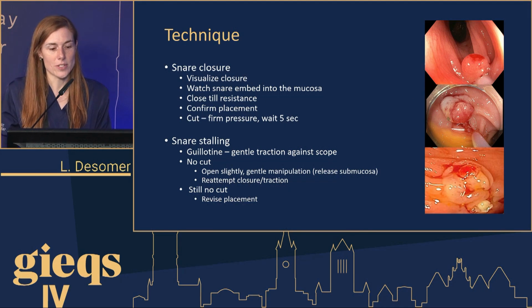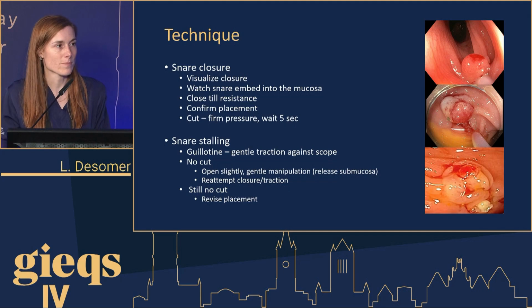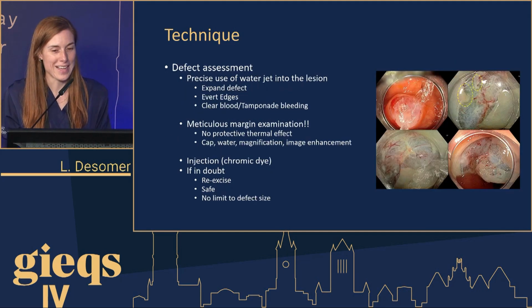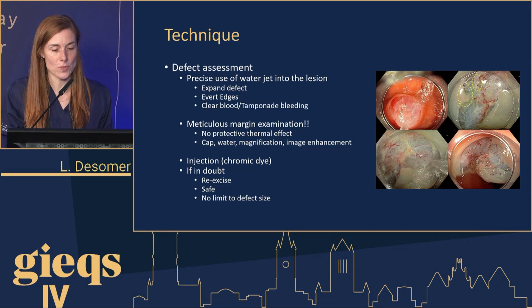Visualize snare closure, close till resistance, confirm placement, cut. If need be, you can do some gentle traction. Never be aggressive. In the worst case, you revise placement, but you do not add HOT, because that will probably lead to some muscularis injury.